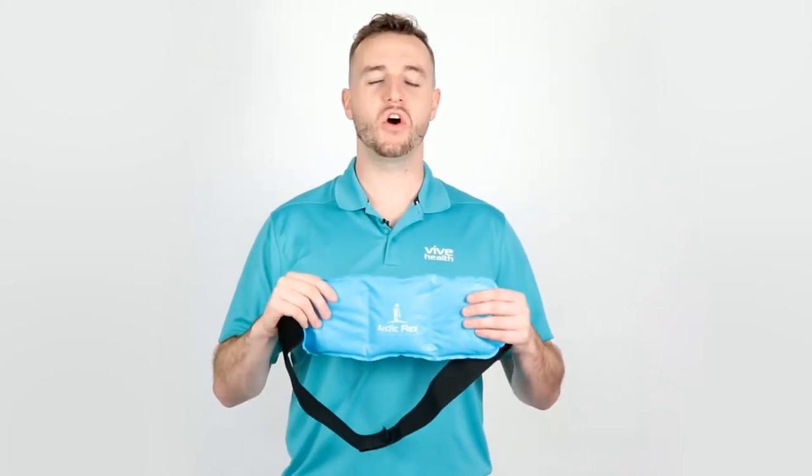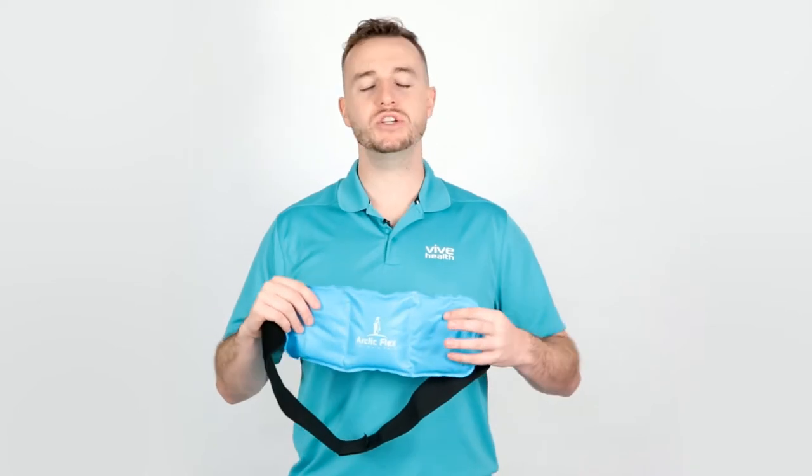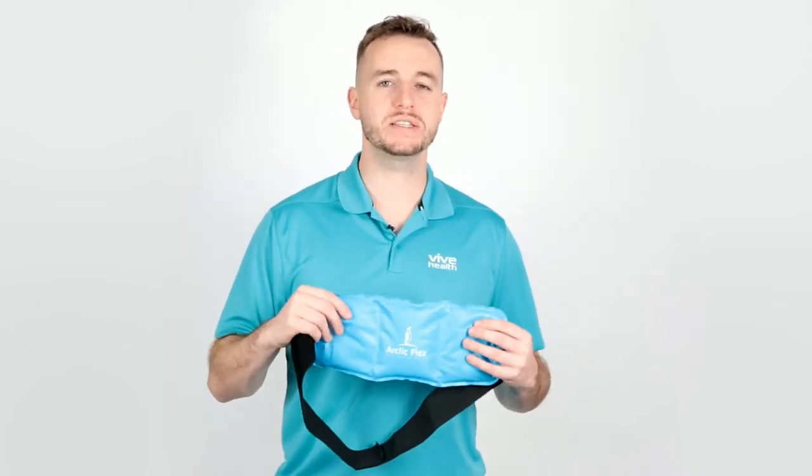Hey, Sam here with Vive Health, and this is the Arctic Flex Hot and Cold Wrap. It's ideal for swelling and inflammation, sports injuries, and body aches.